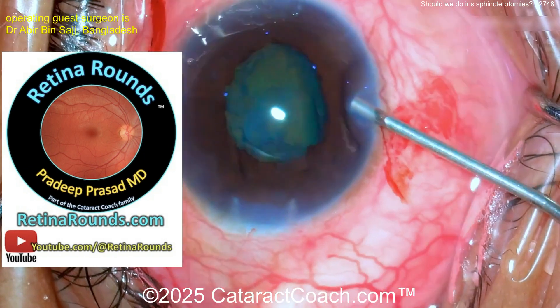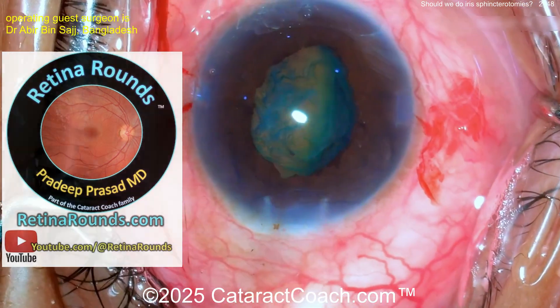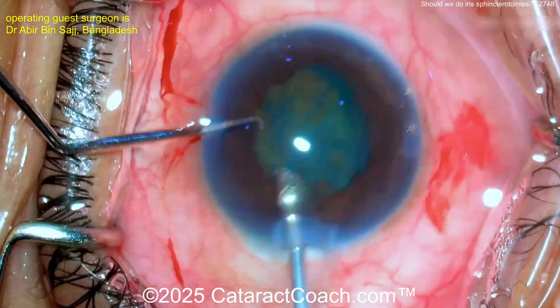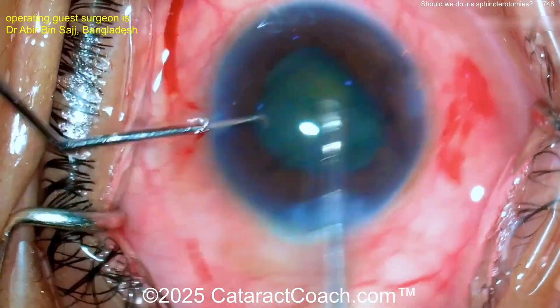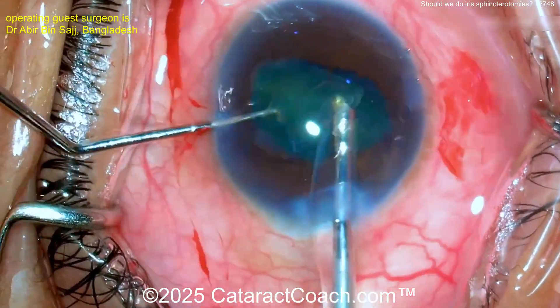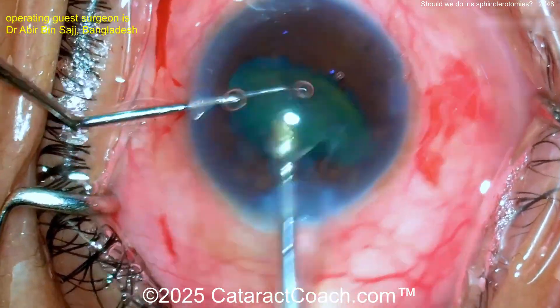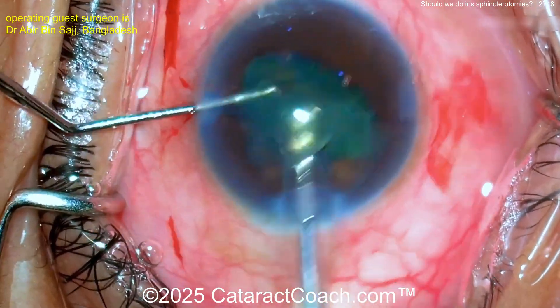Meanwhile, check out our sister channel — a great resource with amazing material. Now there you go — nucleus kind of tilted up. I like that technique, similar to what I end up doing. Looks very reasonable. You take this out and the nucleus comes up pretty easily.